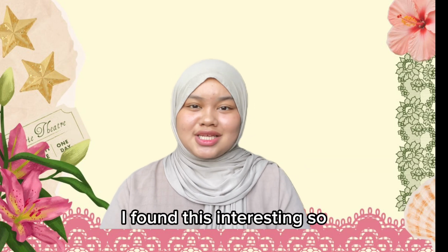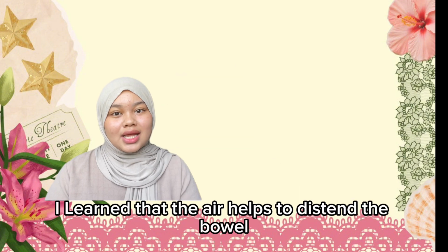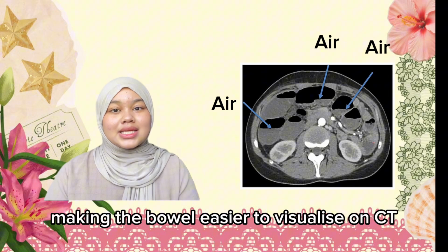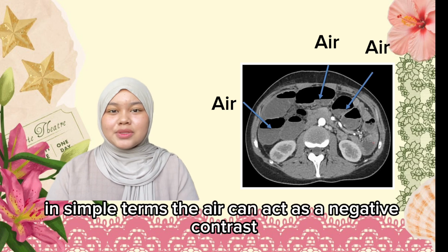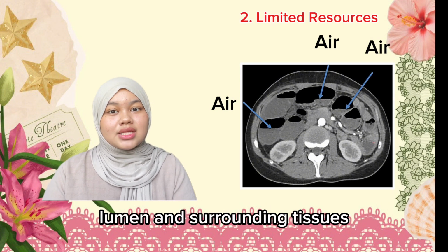I found this interesting, so I asked one of the radiographers about the reason behind this protocol. I learned that the air helps to distend the bowel and separate the bowel walls, making the bowel easier to visualize on CT. In simple terms, the air can act as a negative contrast because it appears dark on CT, creating a contrast between the bowel lumen and surrounding tissue.